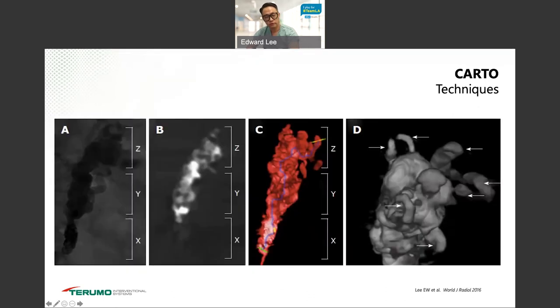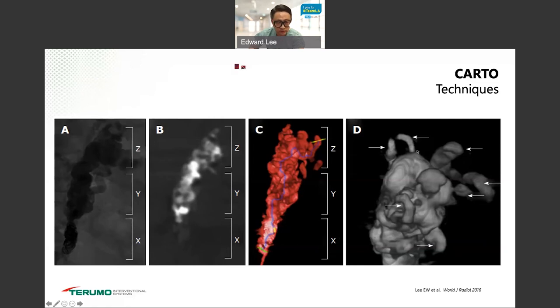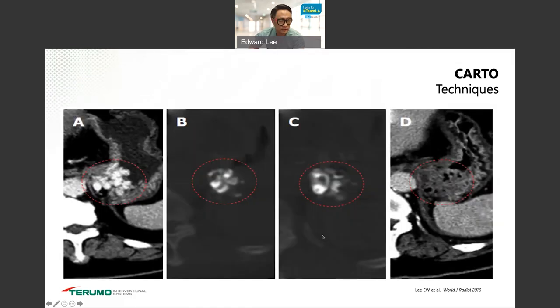We've done several studies using cone beam CT to confirm we got all the varices. On cone beam CT you can see the coil, shunt, and varices. With reconstruction you can see tiny collaterals being embolized with gel foam very easily — whereas with BRTO, these would each need to be individually coil-embolized to prevent leakage of sclerosing agent. This is cone beam CT pre-treatment, and post-treatment showing complete obliteration of varices.